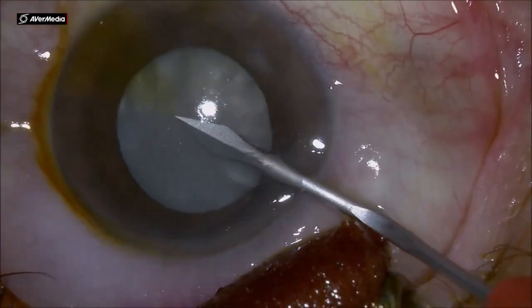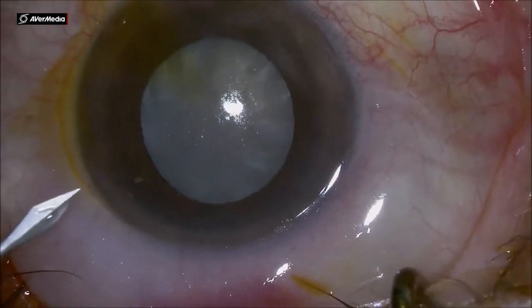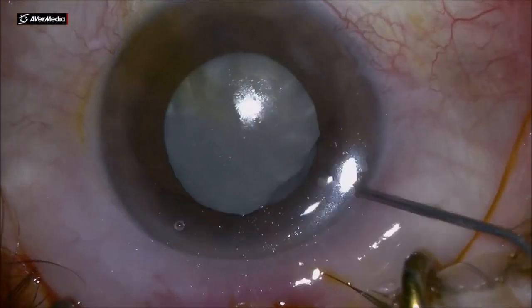Dear colleagues, this is an intumescent cataract, glaucoma patient with a small anterior chamber.